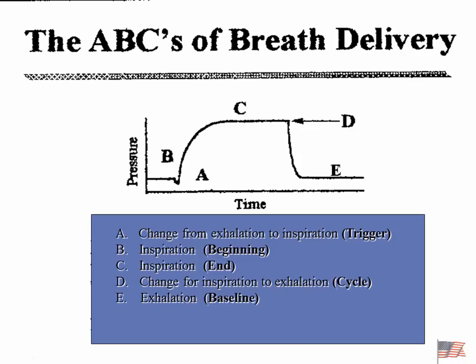All right, so we talk about the ABCs of breath delivery, because we can identify various points in time where there might be something going on. This is basically a pressure-based breath, but you can do the same thing for a volume-based breath.